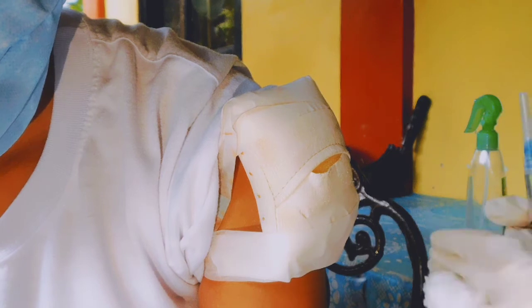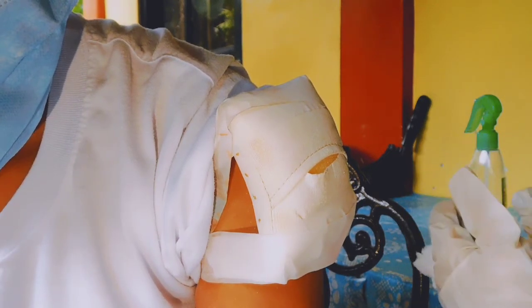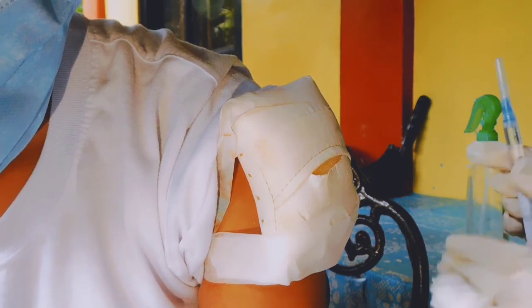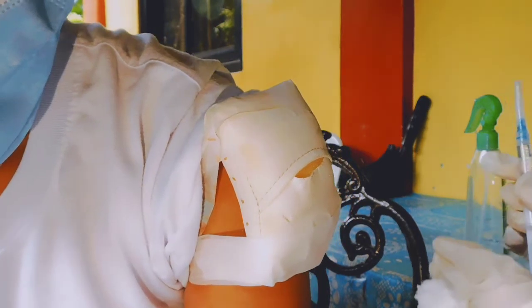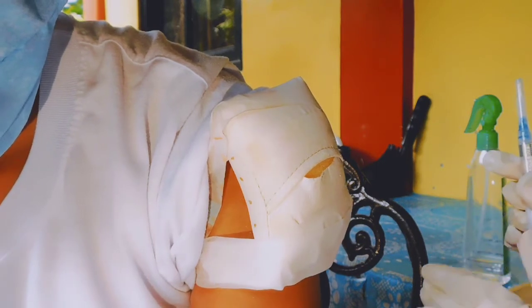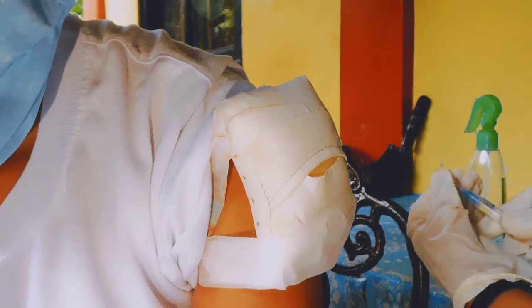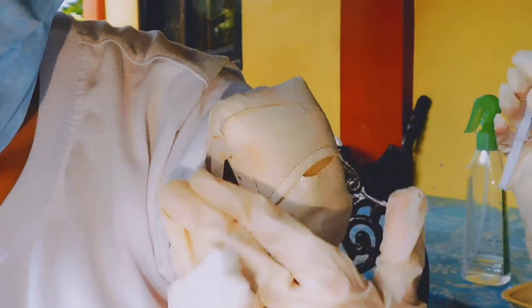While waiting for it to dry, prepare the syringe for injection. Remove the needle cover and discard it without contaminating the needle. If using prefilled unit-dose medications, take precautions to avoid dripping medication on the needle prior to injection. If this does occur, wipe the medication off the needle with a sterile gauze. After preparing, we're going to inject the medication using the Z-track technique.